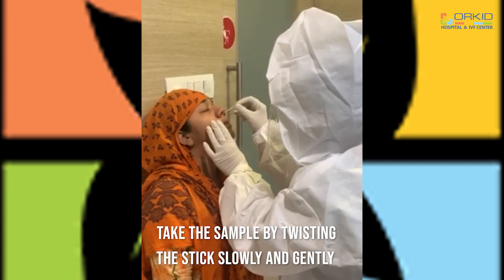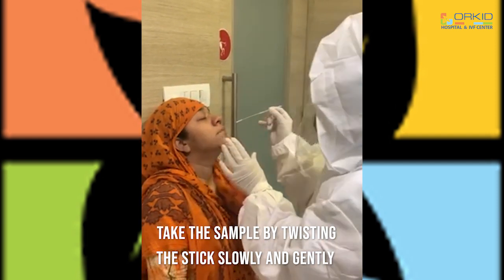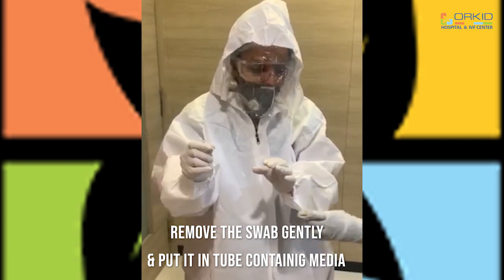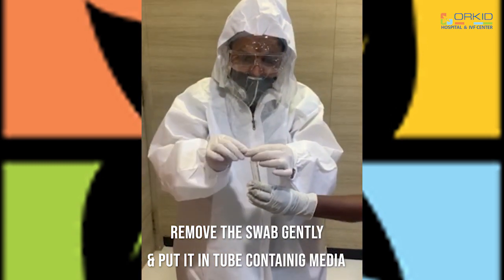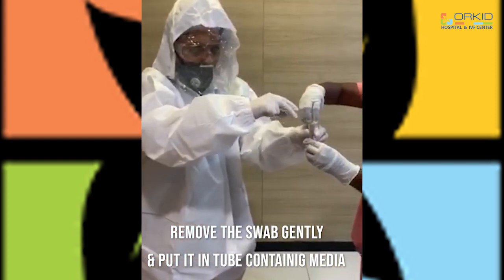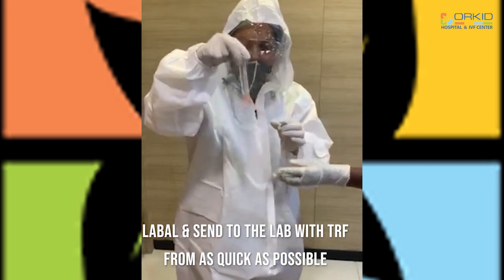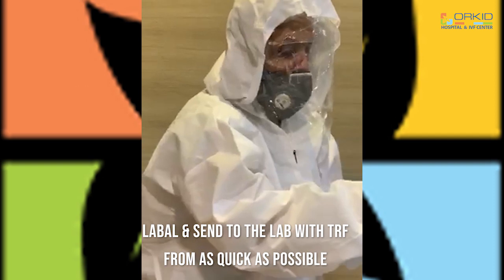Now put the swab stick into the viral transport media. Plug in the lid, then label it, fill up the TRF form, and send to the lab as quickly as possible.